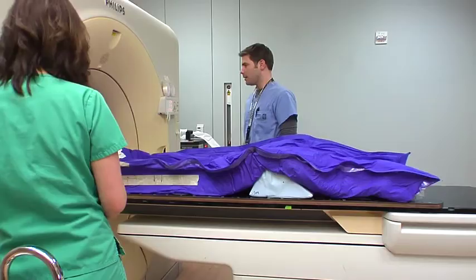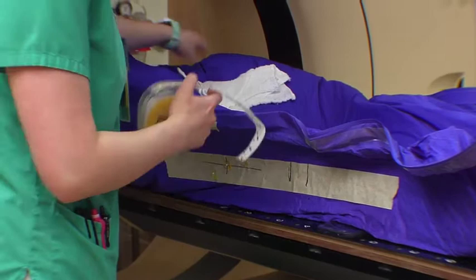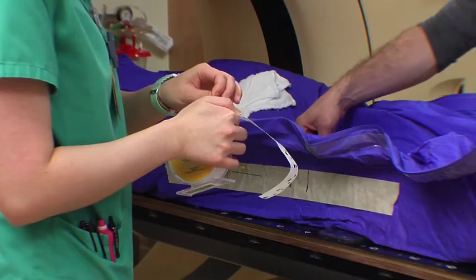It's lined up longitudinally to this BB and we made sure that it's correct left to right. We put a BB in the center of both lasers, and we put one above and one below. And that's it — so now we can get you back on.